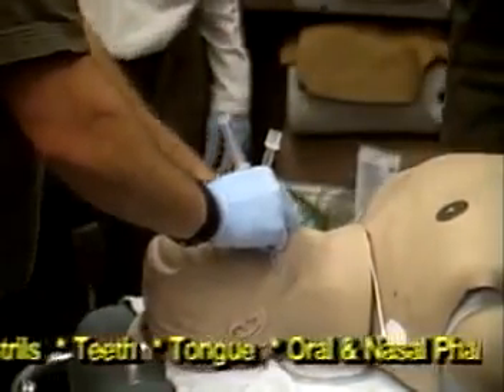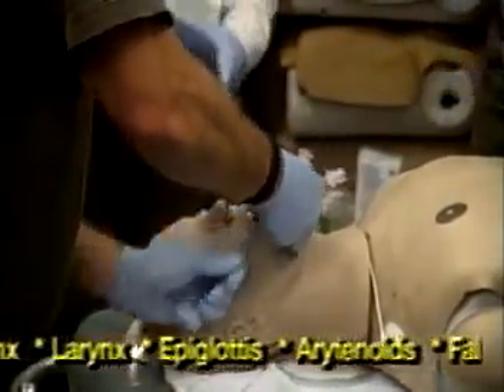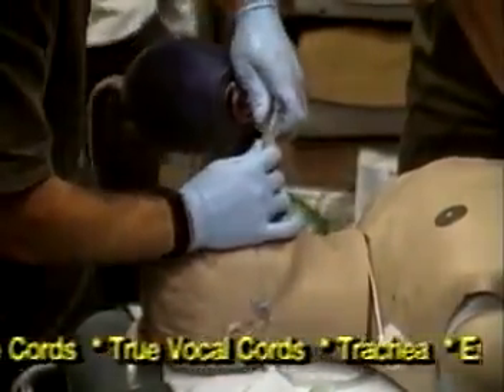tongue, vocal cords, and cricoid cartilage allow you to practice intubation, ventilation, and suctioning techniques.